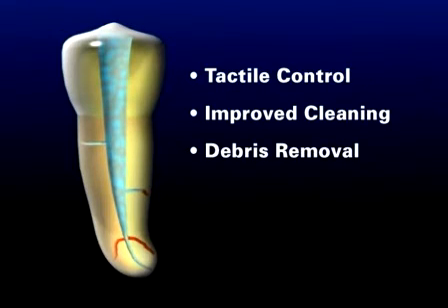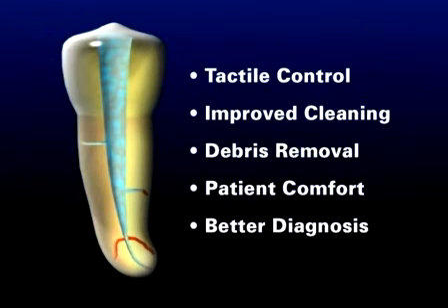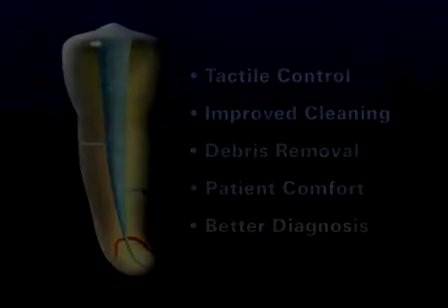Pre-enlargement procedures decrease post-treatment problems, as the bulk of the pulp and, if present, bacteria and related irritants have been removed. Pre-enlargement procedures generally improve diagnostics. A pre-enlarged canal passively accepts a larger file into the apical 1/3, where its terminal extent is easier to visualize radiographically. In fact, electronic apex locators are more accurate when utilized in pre-enlarged canals, as instruments are more likely to snug into dentin towards their terminal extents.